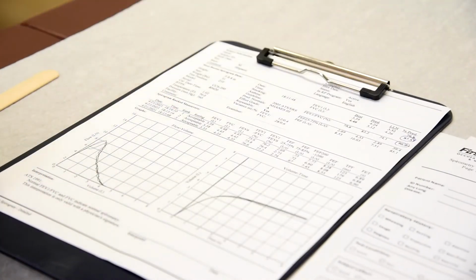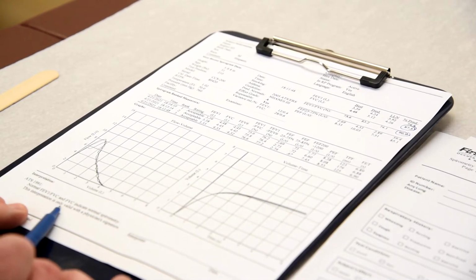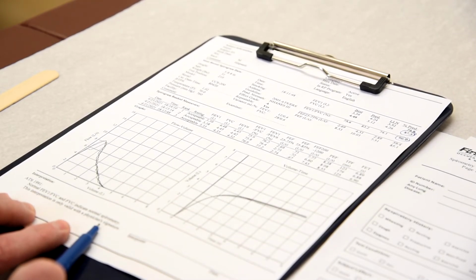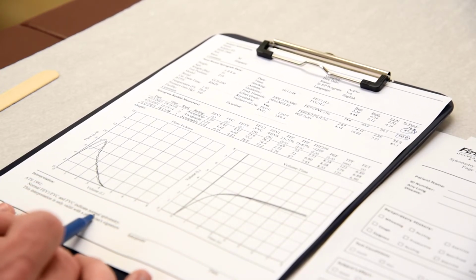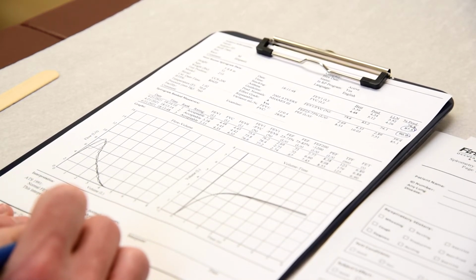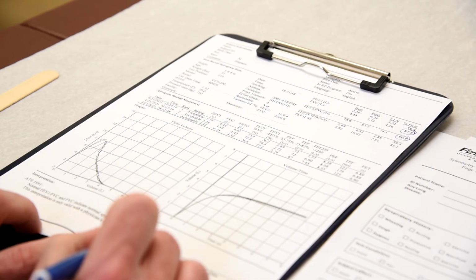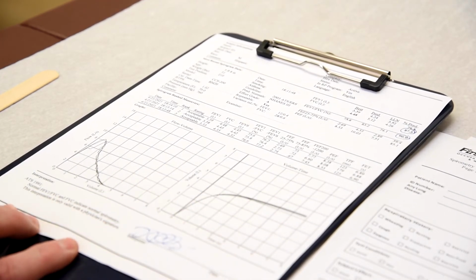we can come back to this page and we can put this to the side, and we can see that just like in our EKGs, the machine will give you a generic diagnosis or interpretation. You can, and this one specifically says, indicate a normal spirometry, or you could write normal spirometry pattern on the bottom and then sign it. And then this is where you would sign your name as such.